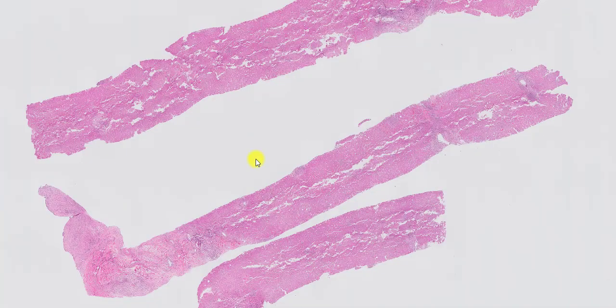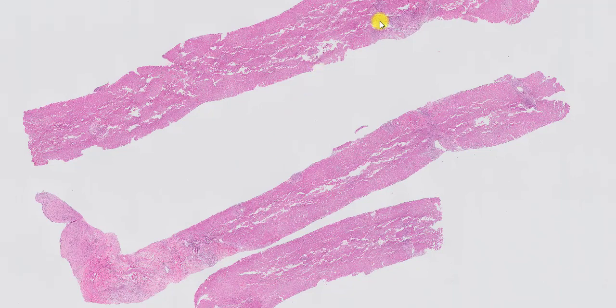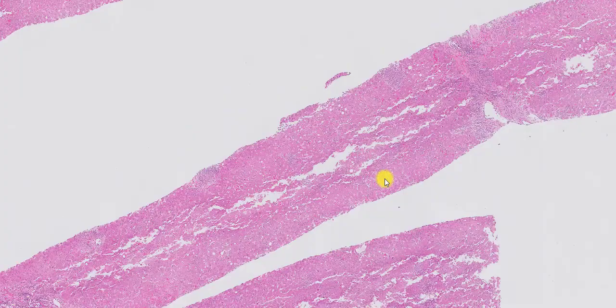Here's a biopsy from a transplanted liver. This woman did not adhere to her medication, and hence this result. When you look at this biopsy under relatively low power, you notice there's a lot of blue. These are portal tracts, and virtually every portal tract has a substantial amount of inflammation. The lobules seem relatively undamaged.